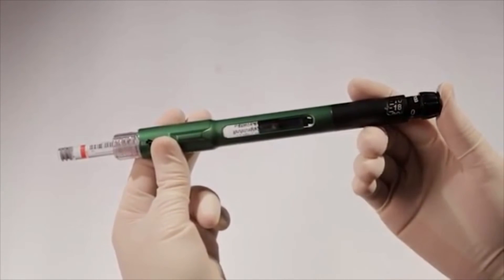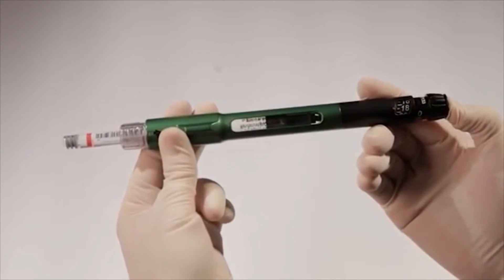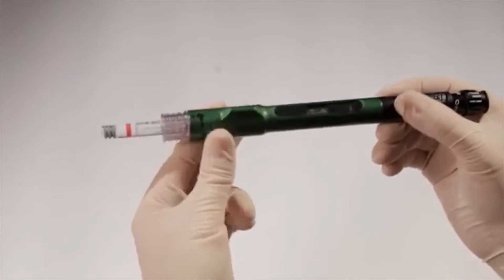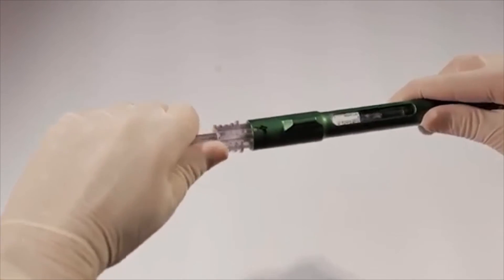If you cannot depress the dispensing button, it's another indication that the 1.8-milliliter cartridge may not be seated correctly in the cartridge connector. Do not force the button if you are feeling resistance — this may damage the pen. Turn the connector to the number one position and remove the 1.8-milliliter cartridge by pulling straight out.